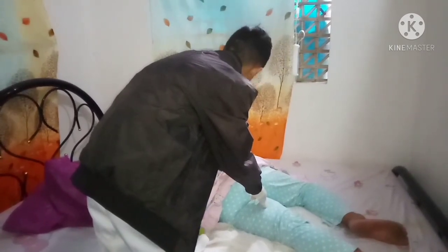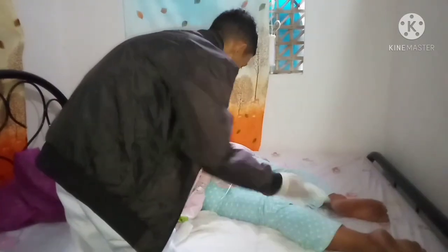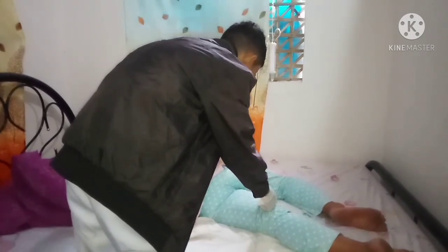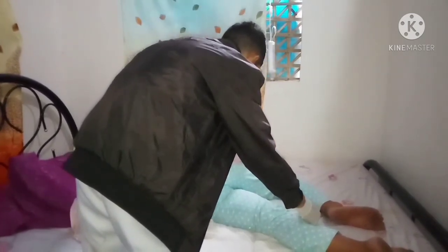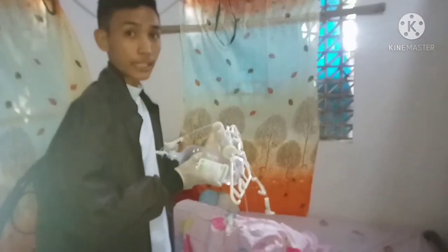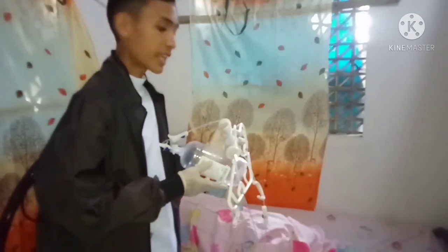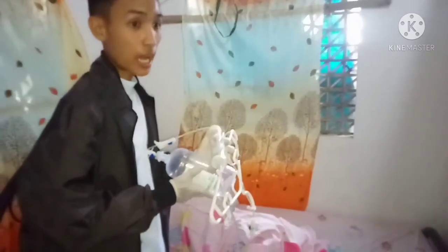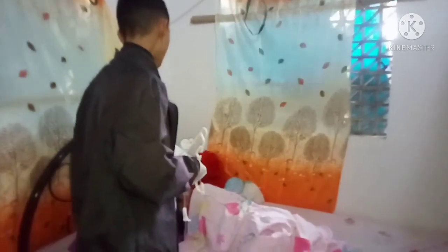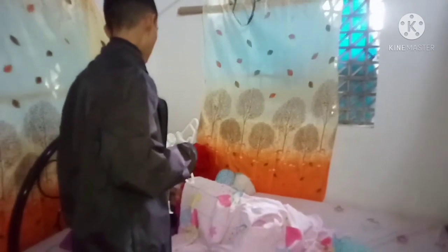Ma'am, okay na, I will remove this now, ma'am. And we will use toilet paper. Assess the client in a comfortable position and cover the client. Dispose of our materials in the proper disposal area, and we need to educate the client especially about the distension. Ma'am, let's allow it to stay for at least 5 to 10 minutes before you go to the CR. Ma'am, it is natural for our abdomen to distend because of the solution we put in.